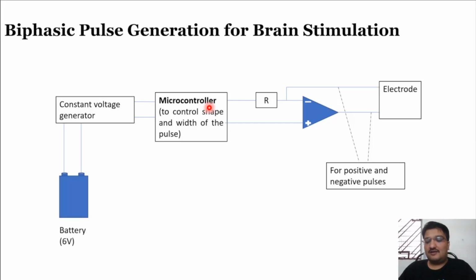I've already covered auditory stimuli and visual stimuli in one of the previous modules. A similar kind of approach is used here. There we used some software which has an inbuilt timer. Here we can use a general purpose microcontroller and program your device to obtain the desired electrical stimuli or periodic electrical waveforms to obtain a particular brain stimulation.